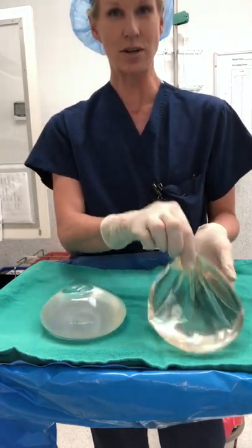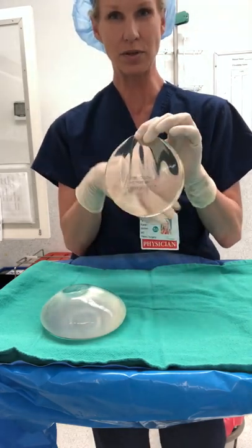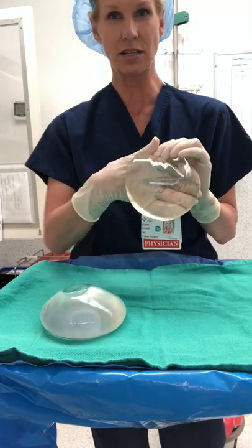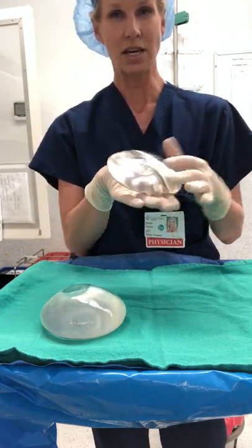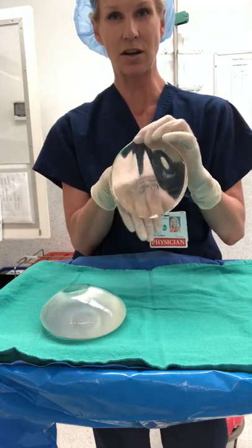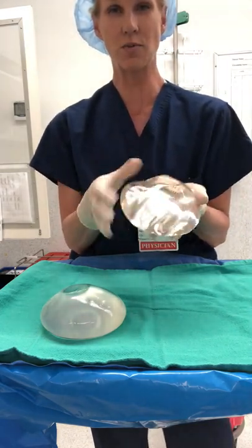A silicone gel breast implant, on the other hand, is filled with silicone gel. Even though you can see some ripples outside the body, usually there's at least a decent layer of padding, a centimeter or two over top, and it changes shape. Both of these implants are smooth and round, but you can see it's more viscous and it flows more naturally.